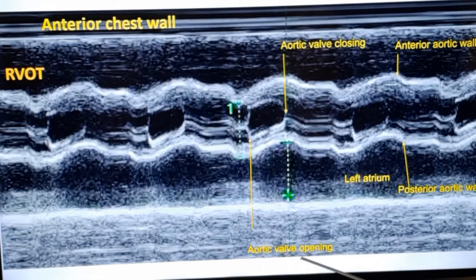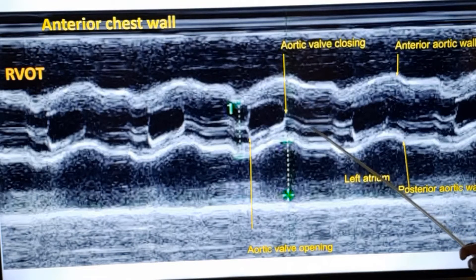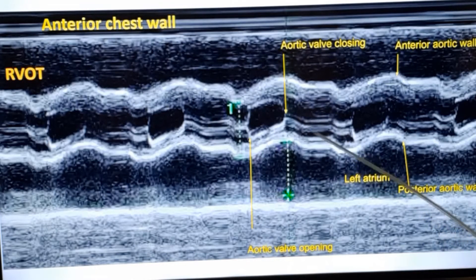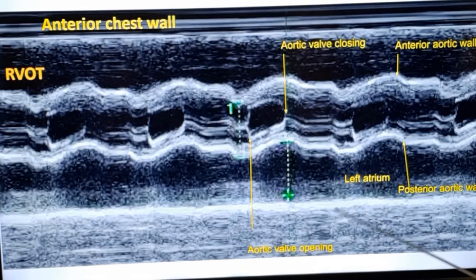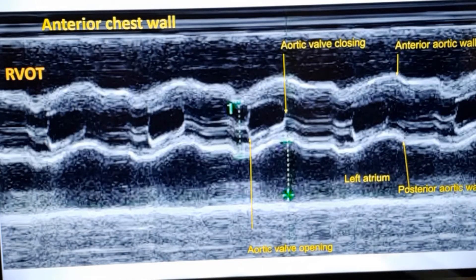Another important thing is the eccentricity or centricity of the closure. If the closure line is in the center, you will say that it is symmetric closure. If it is eccentric either to one wall of the aortic valve, then it is eccentric closure. Eccentric closure can occur in bicuspid aortic valve.